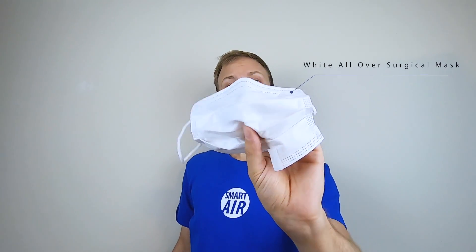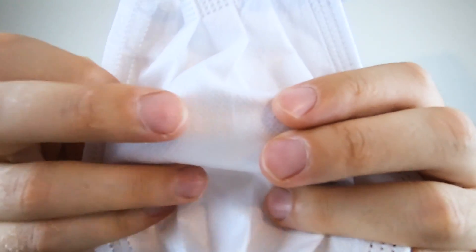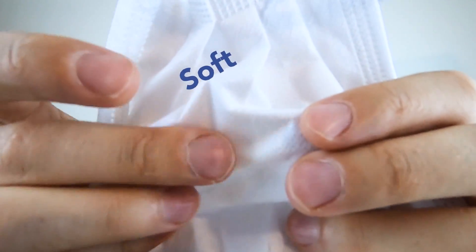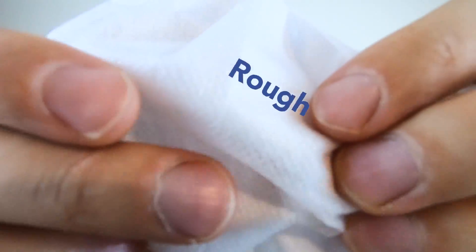If you've got a mask which is white both on the outside and on the inside, you'll need to work a little bit harder to work out the right direction — you'll need to feel both layers of the mask. One side is slightly softer, so this is the soft side of the mask and this is the rough side of the mask.